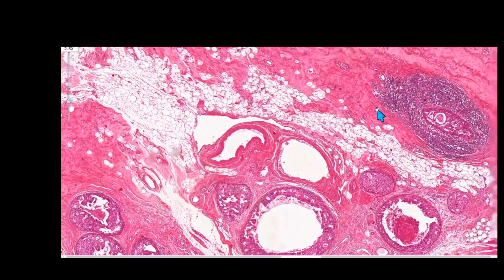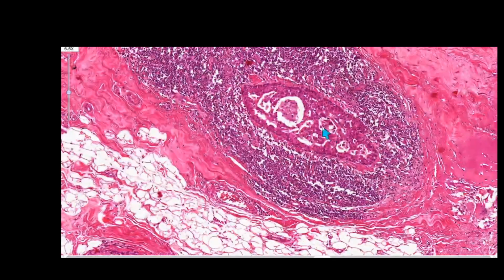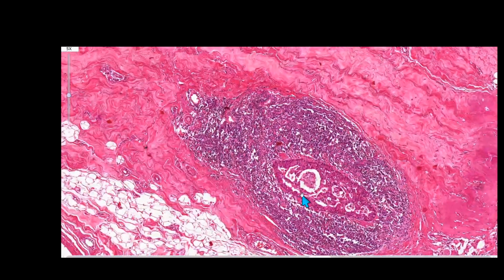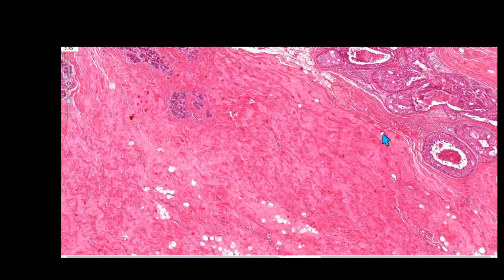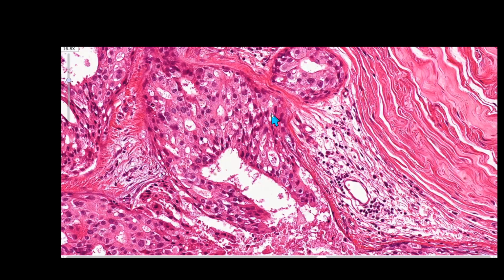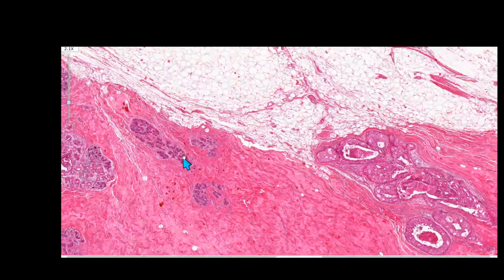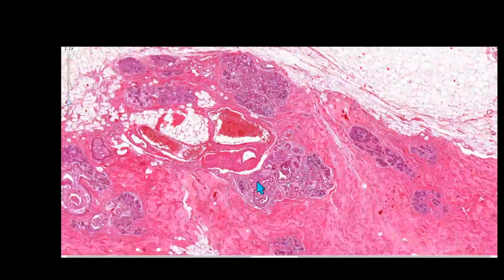Let's look for more. These are all abnormal neoducts. And this one is full of carcinoma and is surrounded by lymphocytes, the so-called periductal lymphocytic infiltration. Intensive research is going on to find out their real role. Here are ducts and duct-like structures. The cancer cells distend all these cavities. Once again, we arrived at normal TDLUs here, but the cancer is here.